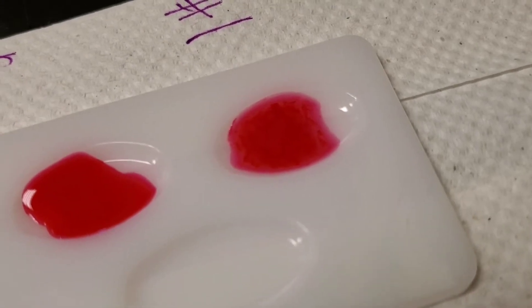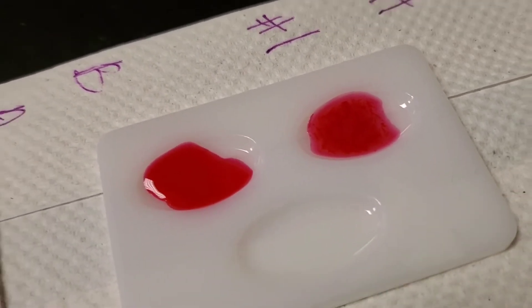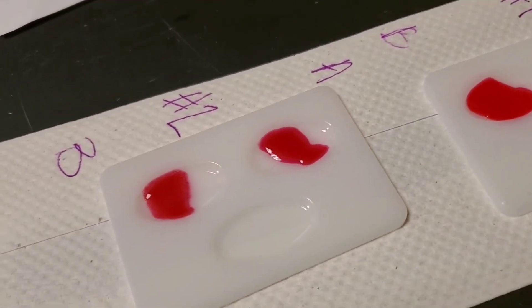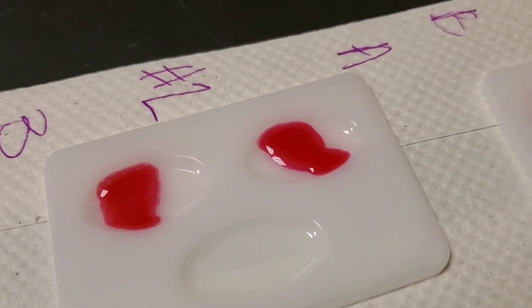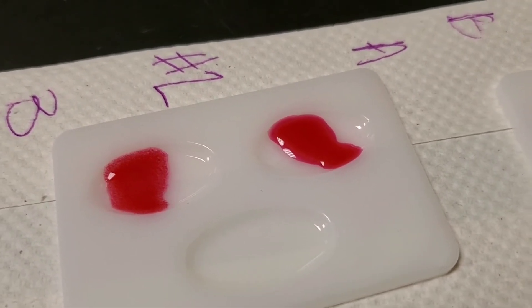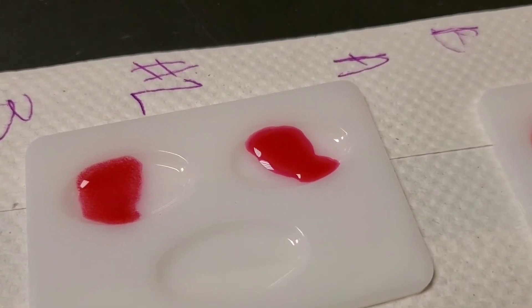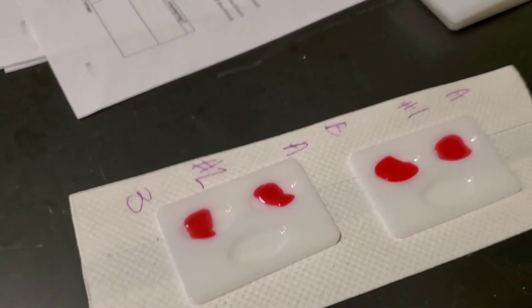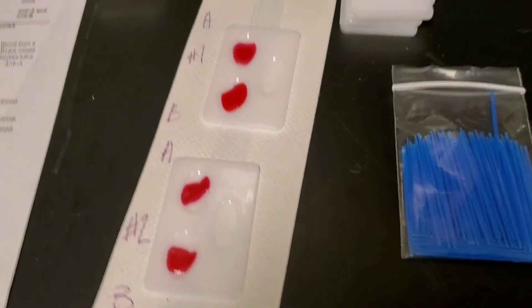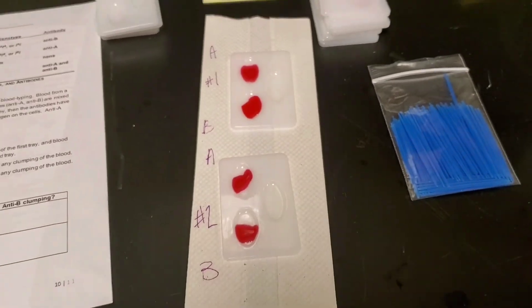And now in patient two we did the same thing. The only difference here is there's a different kind of blood, but anti-A in well plate A and anti-B in well plate B. There are the results, so you can interpret the results to complete your lab report. Let me know if you have any questions.